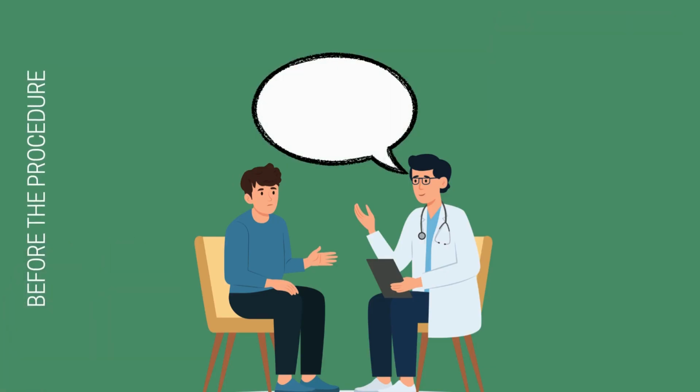Next, move into your patient interview questions. Ask if they've had blood drawn before and if they've ever felt faint or dizzy. Check for any history of bleeding disorders or if they're on blood thinners. You'll also want to ask about fasting. You may state that as, "Have you eaten today?" Or ask if they have any IVs, ports, or a history of surgery that might affect which arm you use. Don't forget to ask the patient about their allergies, especially to latex, adhesives, or antiseptics that may be used during the phlebotomy procedure.